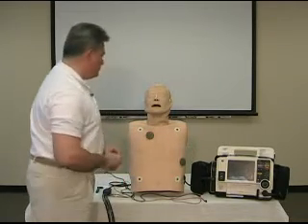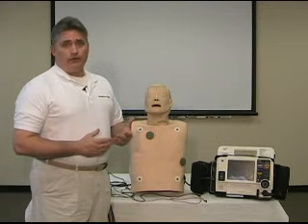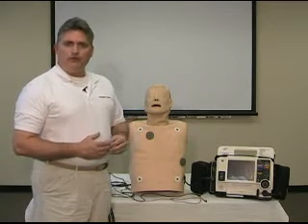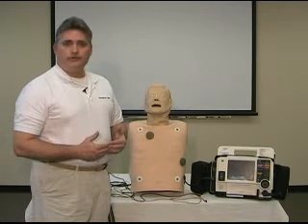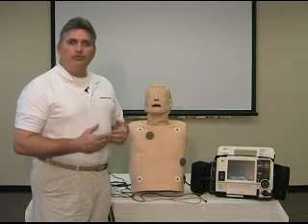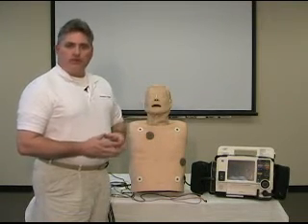This actually removes any dead skin and will greatly enhance the electrode's ability to adhere to the skin and reduces any type of impedance. Even with good skin prep, you'll still get artifact. Things like patient movement, loose cables, vehicle movement, and electromagnetic interference. The key is to reduce the artifact as much as possible. All right, let's talk about lead placement now.